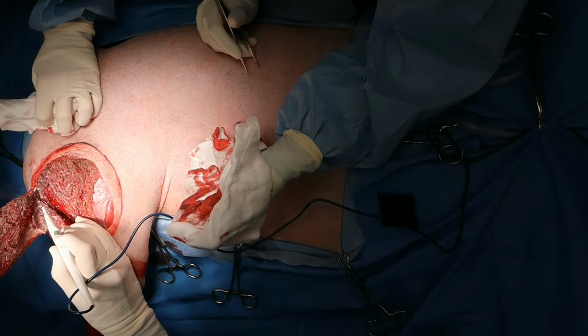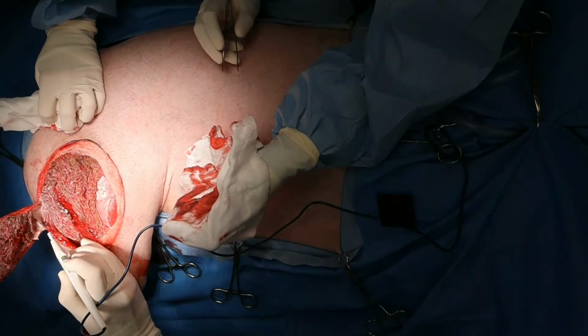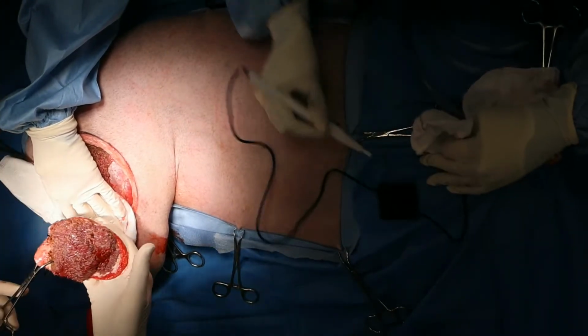Can I get some bupivacaine, please? All right, so that's my partial thickness fascia underneath that, so you can see that really clearly.